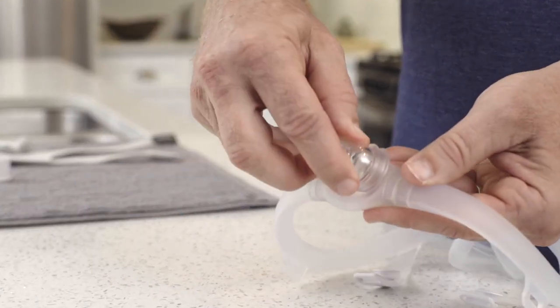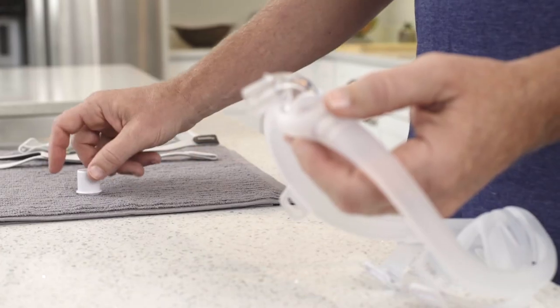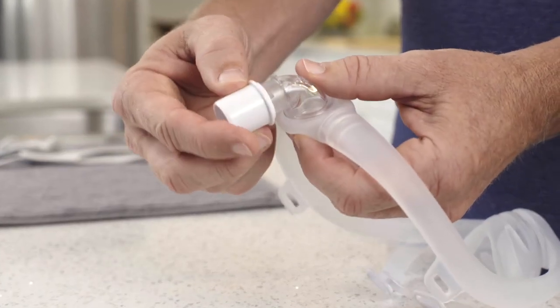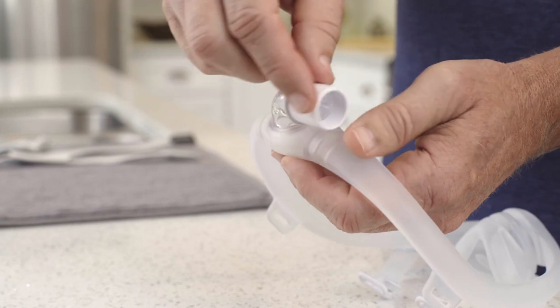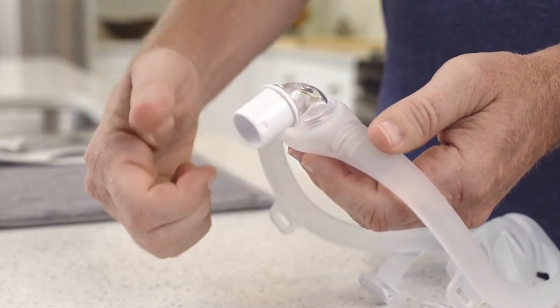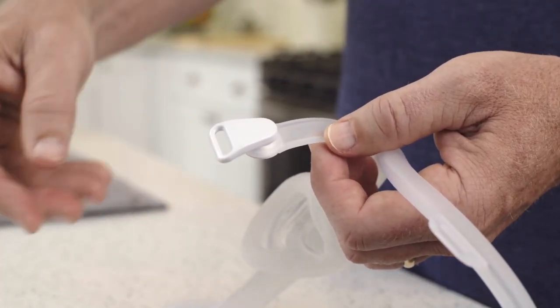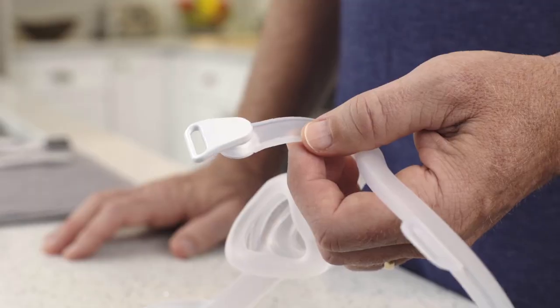Insert the elbow into the top of the frame sizing connector. Place the tubing quick release onto the elbow or into the CPAP hose. Notice that the elbow and tubing quick release have 360-degree swivels. Snap the front end of each magnetic clip to its circular receiving part.